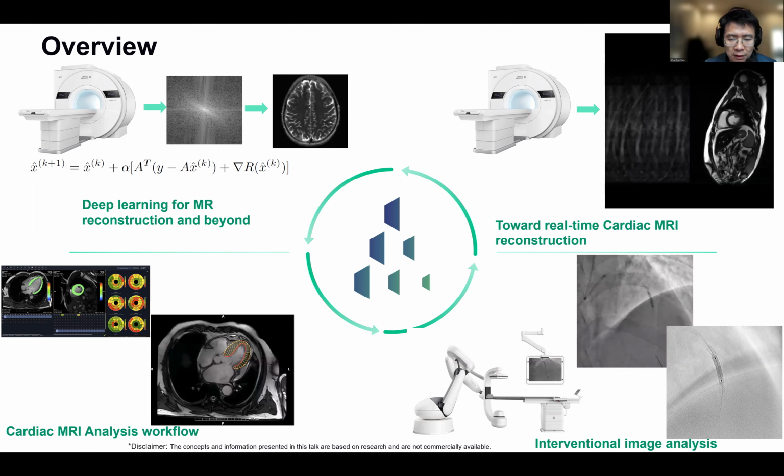Eventually we get the recovered image. If we look at this gradient descent update rule, we could utilize a neural network to predict the delta change in one gradient descent update. The gradient descent update rule can be learned through either a recurrent neural network or a neural ODE. In my talk, I will cover these two directions.